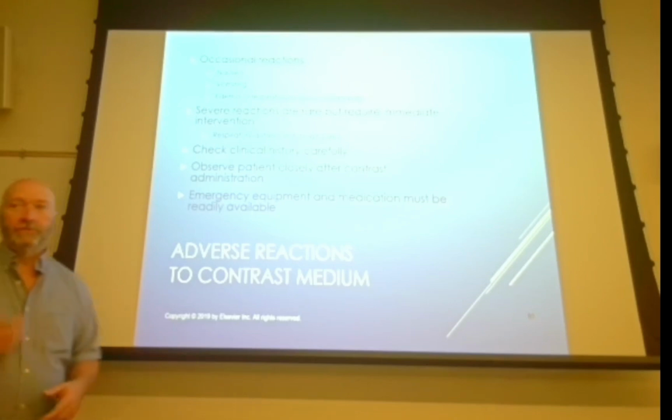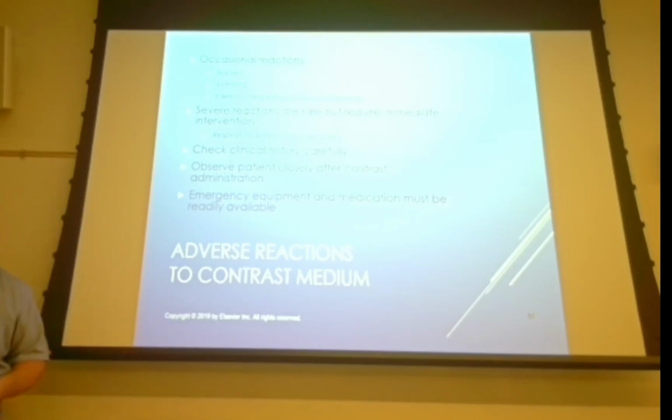You need to make sure that you've got somebody present, a radiologist close, to administer medication if the patient goes south, a nurse, somebody that is more familiar with medication than what you are. If the patient starts to feel a little lightheaded, in a lot of cases that again is a consequence of injecting 100 cc's into the patient.